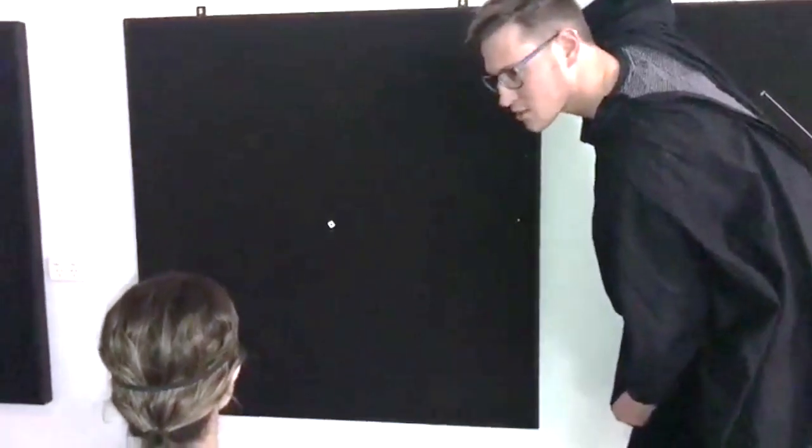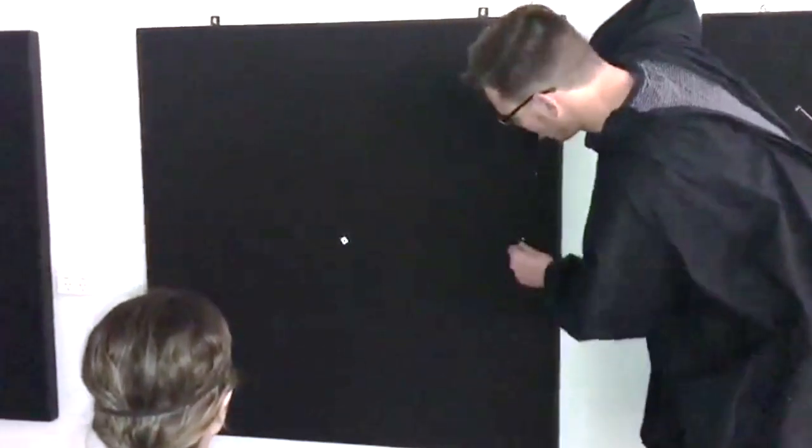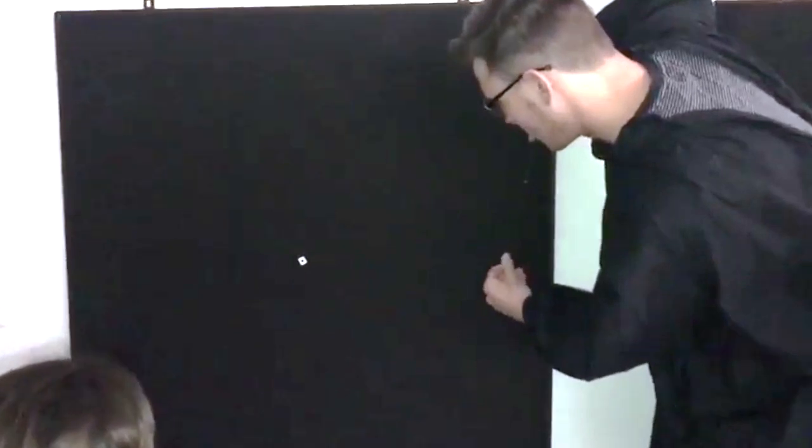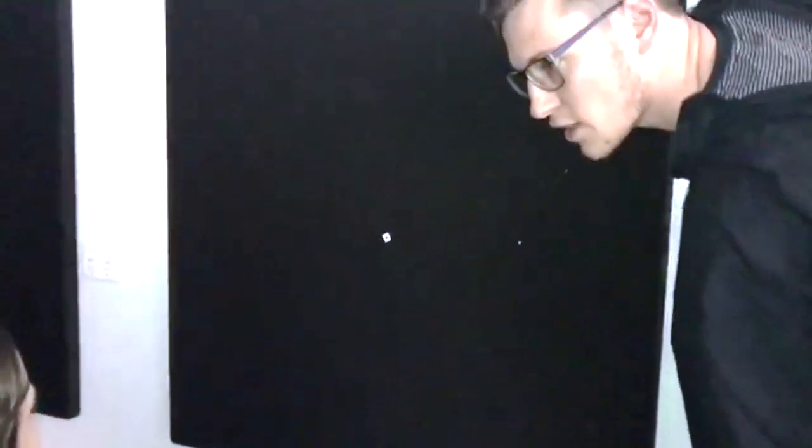When mapping out the blind spot, the examiner will ask the patient when the stimulus first disappears. The patient is asked to let them know when the white dot first disappears. Patient responds that it has disappeared and they cannot see the white dot or anything.